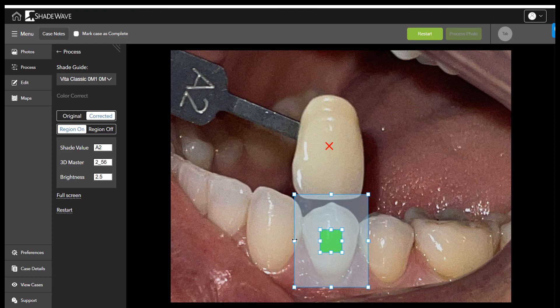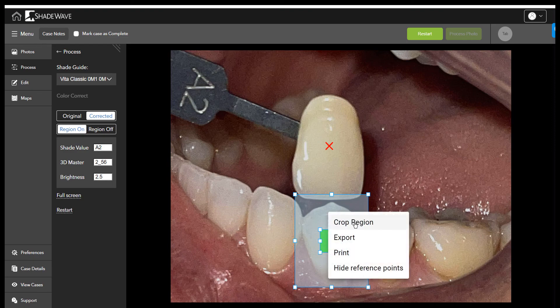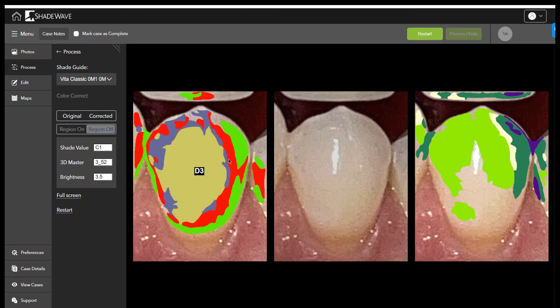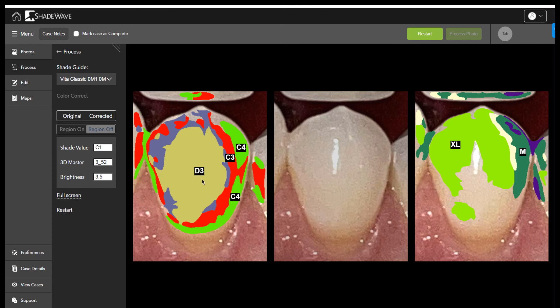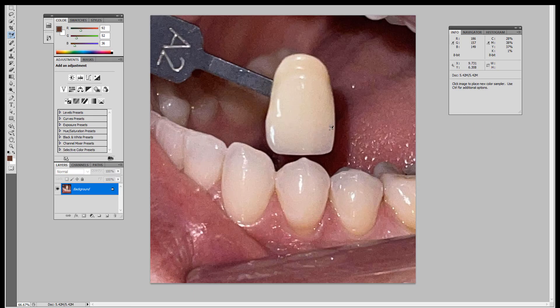Move the region to encapsulate the tooth, right-click, and crop. The results show D3, C3, C4 — which are darker or lower value than the A2. Looking at the map on the right, this is the translucency map showing extra light, light, medium, and dark. It's picking up a lot of gray in the tooth, showing significant translucency. The base shade is D3, but you must build in this translucency or it won't match.